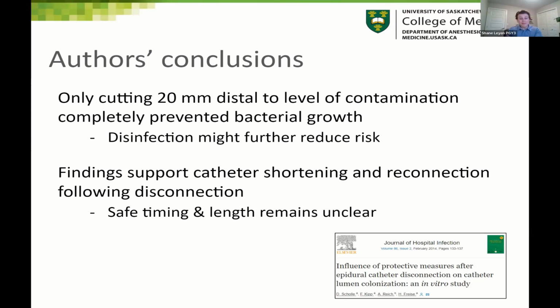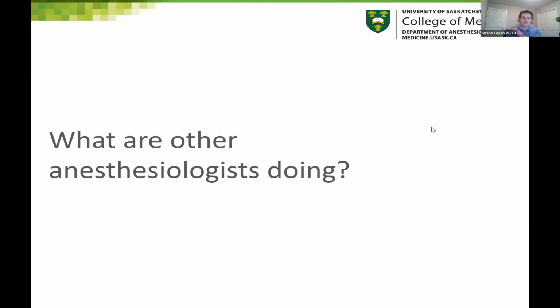I think a few caveats with this study are that they had empty epidural catheters, and that the bacteria might behave differently when there is a fluid interface rather than an air interface. But it did show that cutting did prevent bacterial growth in this study. Next, we'll move on to what other anesthesiologists are doing.